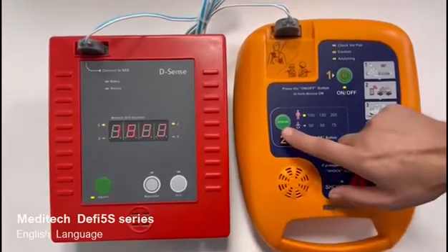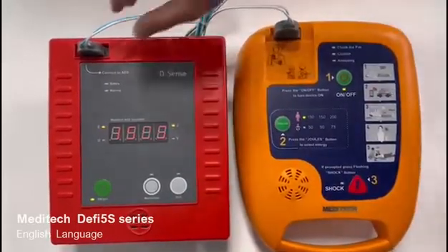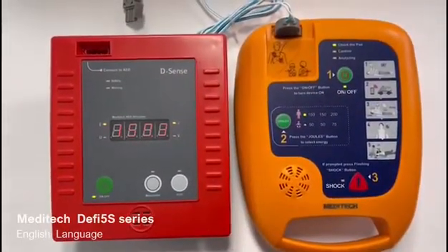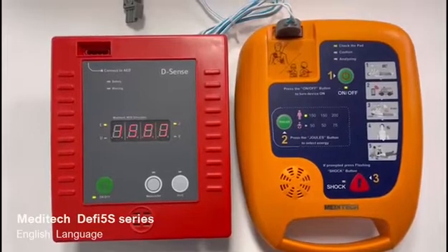Analizando. No tocar al paciente. Coloque los electrodos sobre el tórax rasurado y seco. Electrodos pediátricos. Controle la colocación de los electrodos. Conecte el cable.